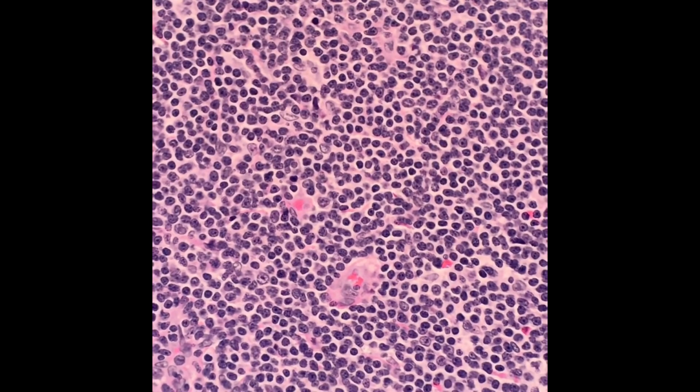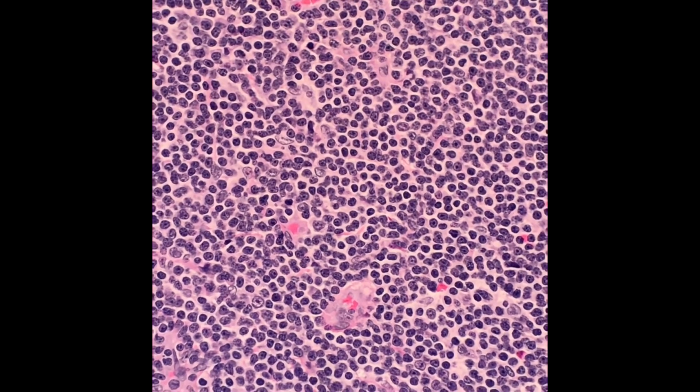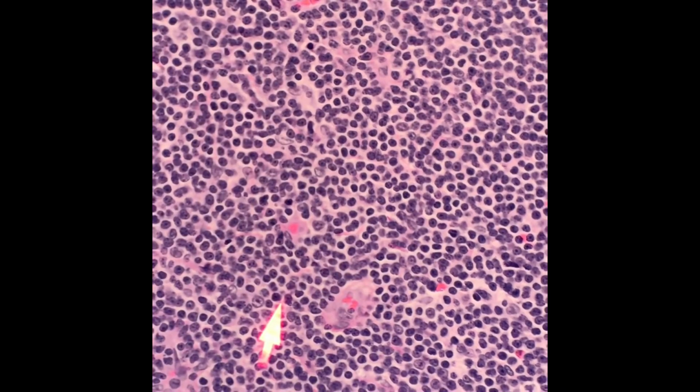So the first thought that crosses my mind is they're small cells, because on low power they're predominantly blue. We come here and that theory is confirmed. We have mostly small lymphocytes, mostly round, perhaps slightly irregular, with very condensed chromatin, inconspicuous nucleoli, little chromocenters. And the thing that strikes me is the virtual absence of large lymphocytes. There may be one here, but even that's only about the size of a histiocyte nucleus.